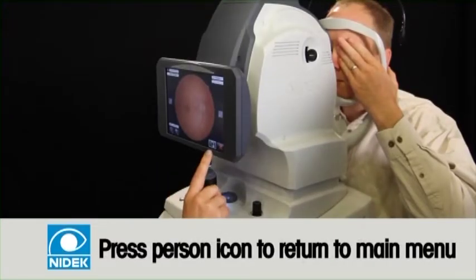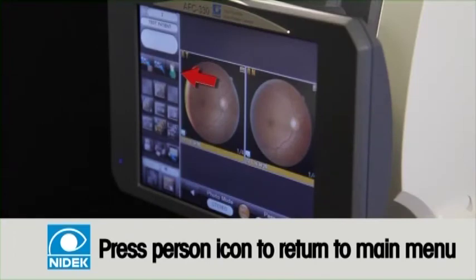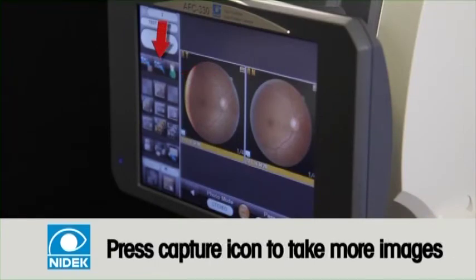If the image is accepted, select the person icon to return to the main screen without patient information. If additional images are needed to be captured, select the capture icon to return to the main screen while remaining in the same patient's account.